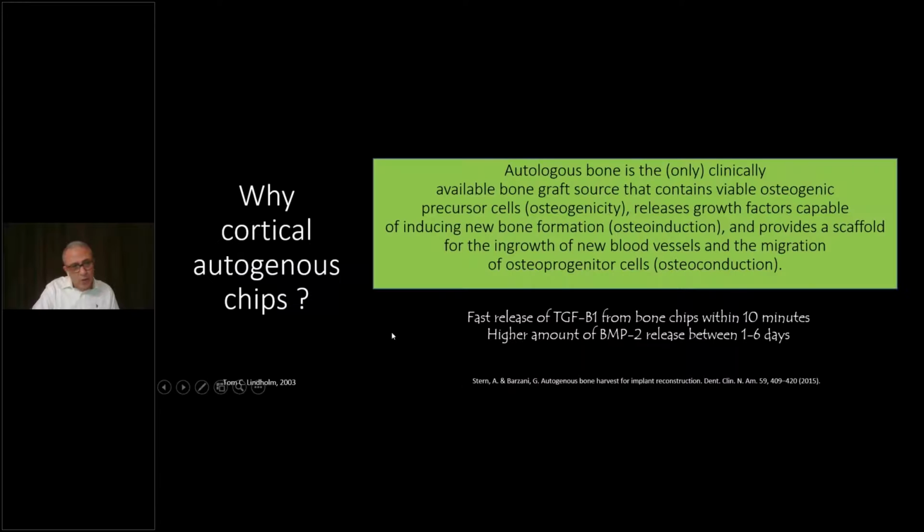But why cortical chips? Why chips? Chips have been investigated in the literature several times. First, they have a fast release of TGFs, and also they have osteogenicity, osteoinductive capacity and osteoconductive capacity, as has been studied in the literature.